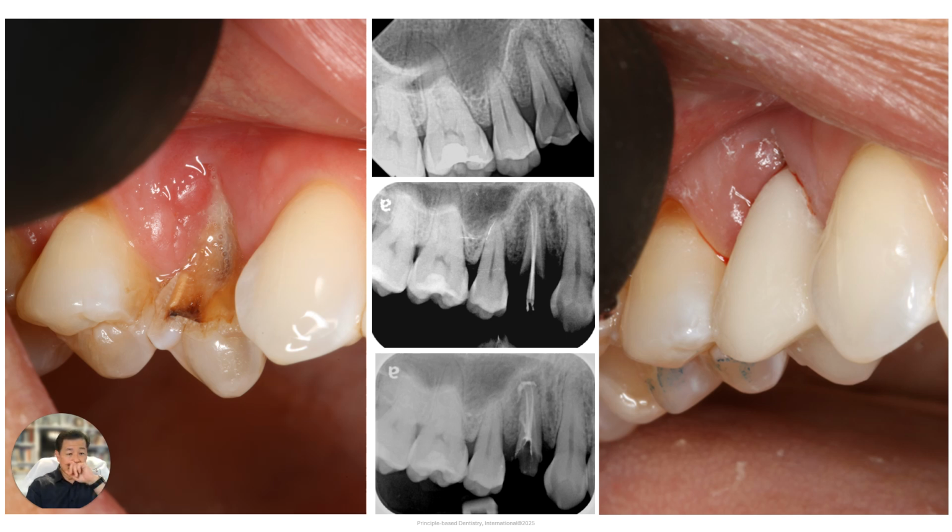My concern was that the portion of the tooth that was left on the lingual half of the tooth was soft. There was decay. You could see that brown area of decay. So I was really concerned when I got in here to see how strong the tooth was going to be in this area. So we discussed the possibility of doing a root canal, core buildup, and a crown.